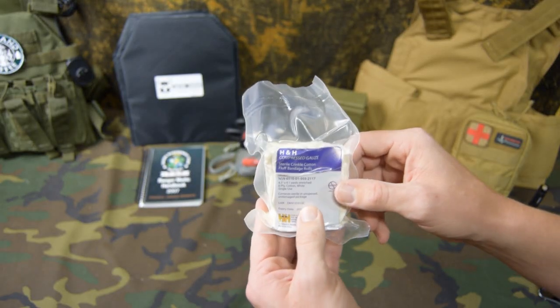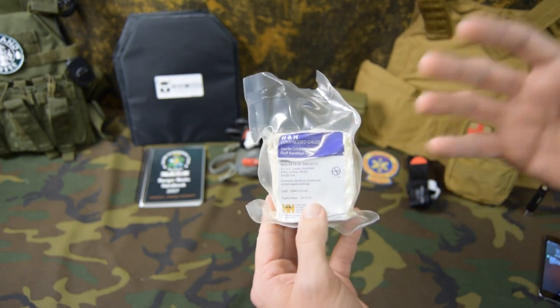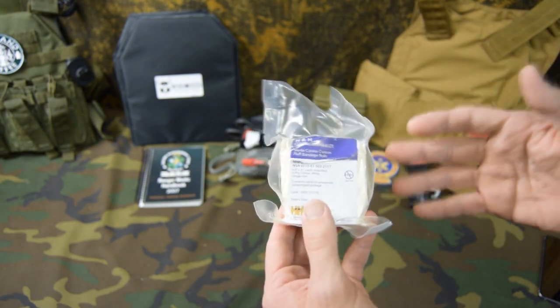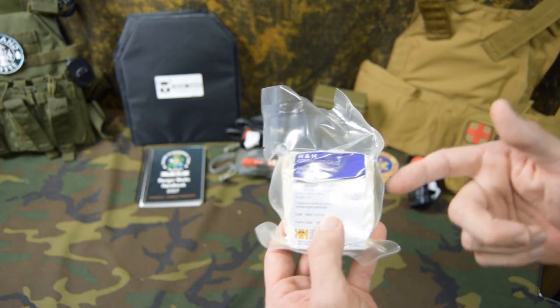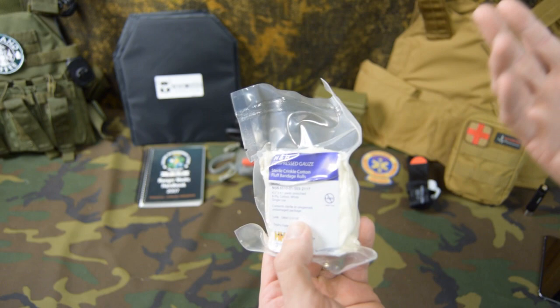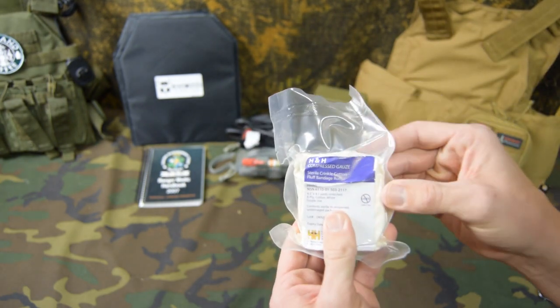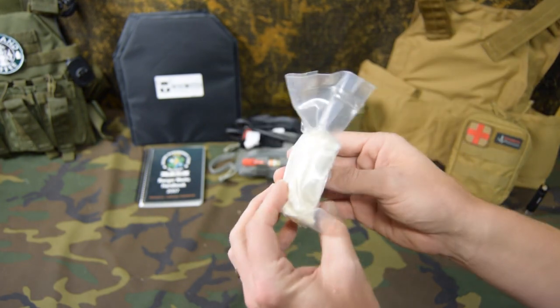Welcome to another video from Skinny Medic. In this video we're going to talk about the H&H Compressed Gauze. I want to show you what it looks like, show you what the packaging looks like, then I'm going to open it up and show you what the gauze looks like inside. And then lastly I'm going to show you how to use this. These things are fairly inexpensive, but you don't want to open up all of your stock that you have in your IFAC, so that's what this video is intended for.